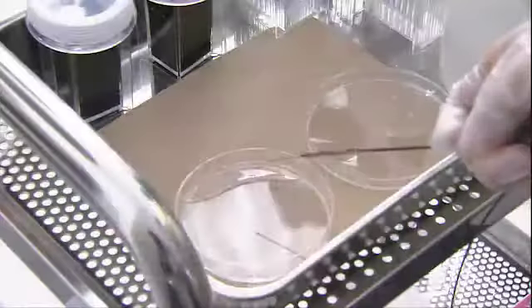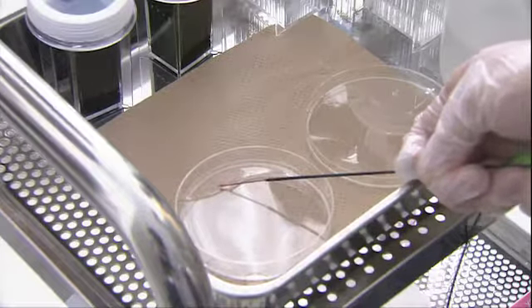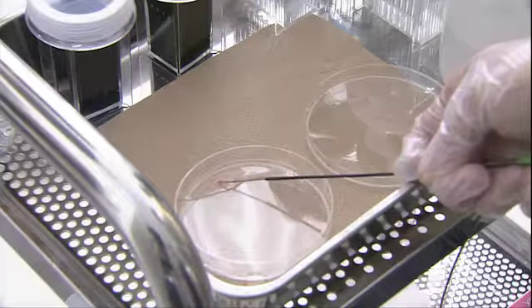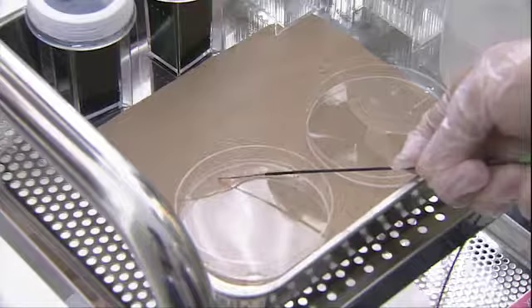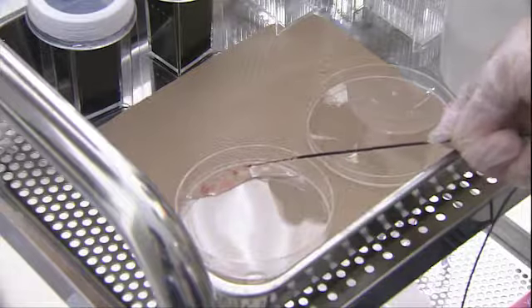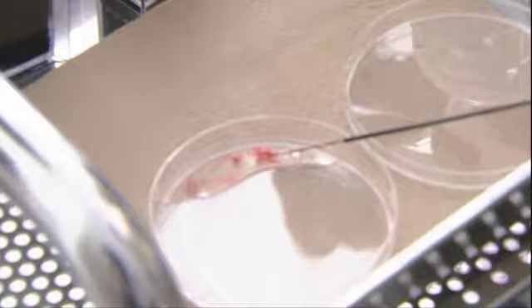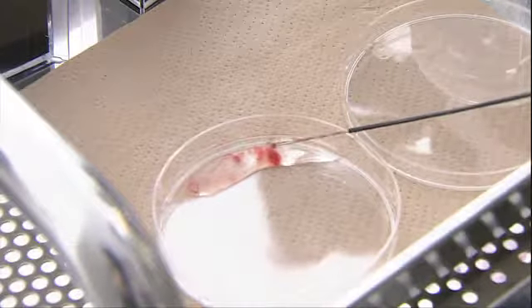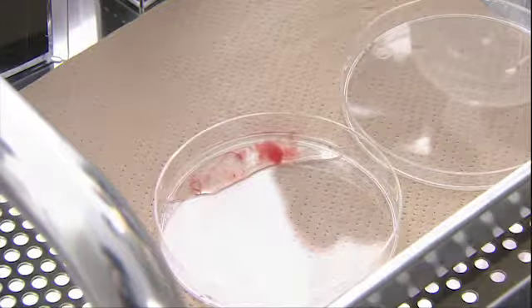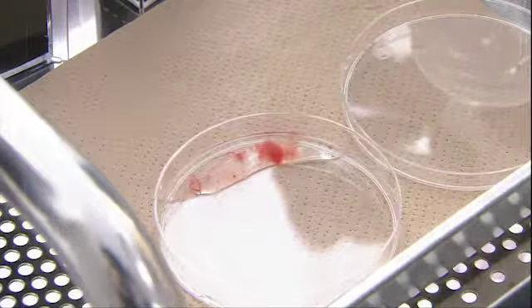Would you have used a different type of needle? No, I think for this case it's a very good decision for the 22 gauge needle. We were also discussing if this cystic lesion may be a form of pseudocyst. That would also be possible because it always irritates us that there are such cystic areas within the submucosa. Or what would you say? Yeah. The one thing that doesn't really go along with the pseudocyst is that this is much more lobulated type. It seems to be connecting through, and this location is within the submucosal layer. So it's very unlikely this is a pseudocyst.